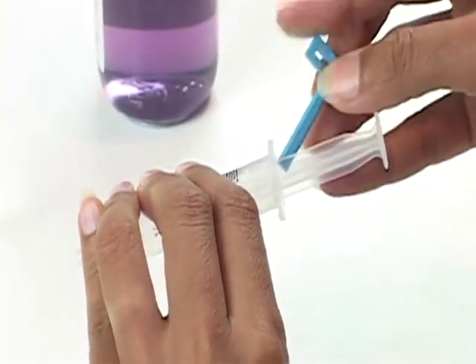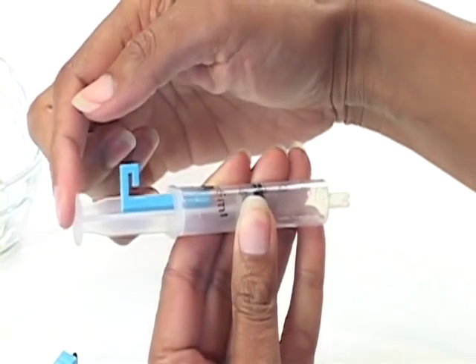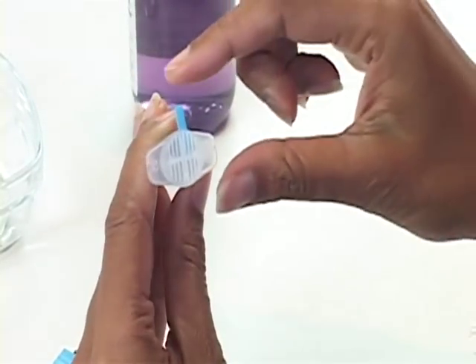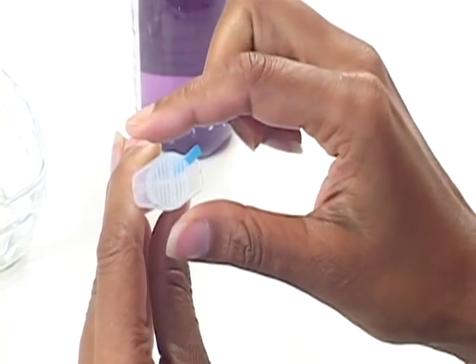Take the clip and insert it into any one of the four quadrants on the side of the piston. Press the piston back into the body of the syringe. Rotate the head of the clip such that it engages with the finger flanges.